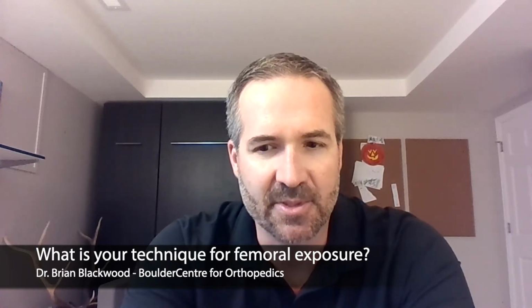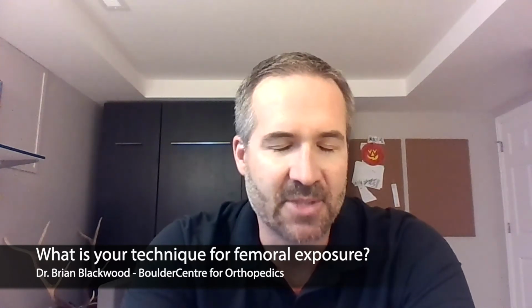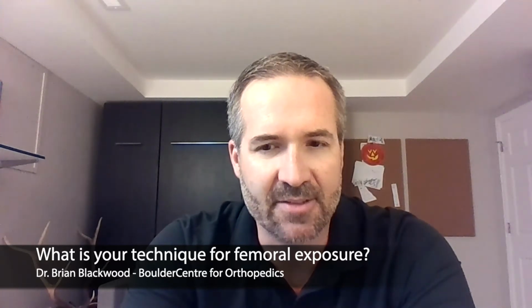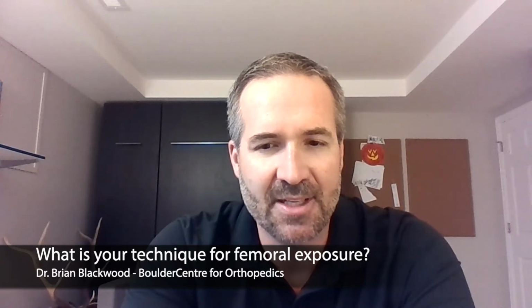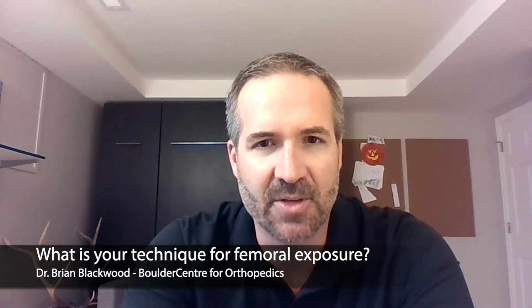I think that allows us to really control our releases and really see what's holding us back without having to try to drop the leg fully initially and then kind of fight through a lot of different soft tissue and tension. I think it makes it a little bit safer, so you're not putting so much pressure on the trochanter with a big initial drop without those releases being performed.